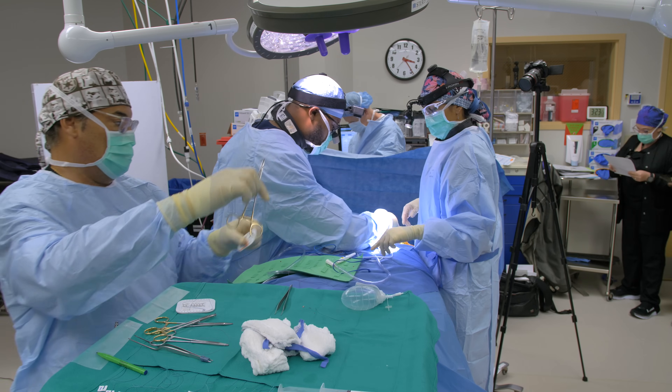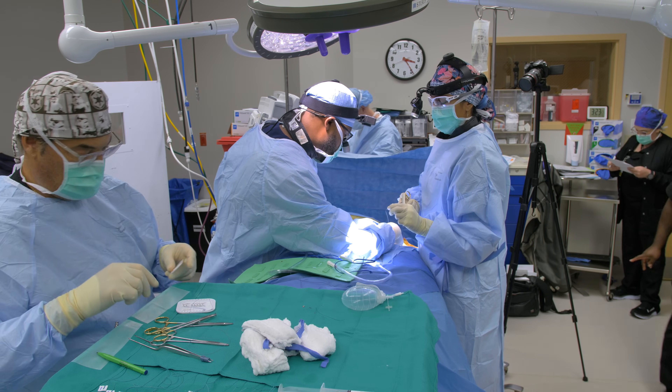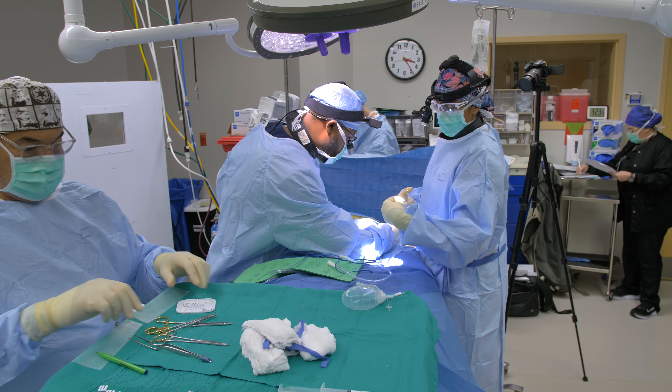We did the whole surgery through about a three and a half to four centimeter incision.